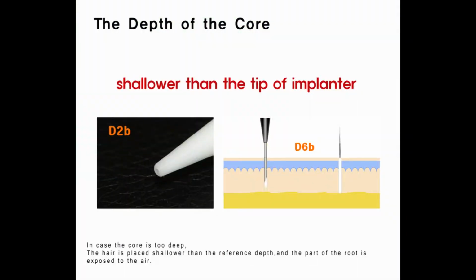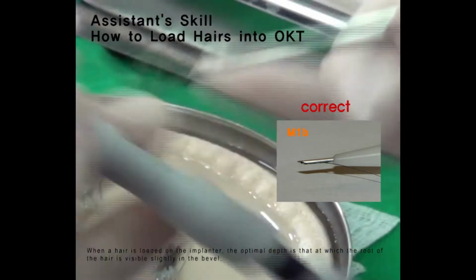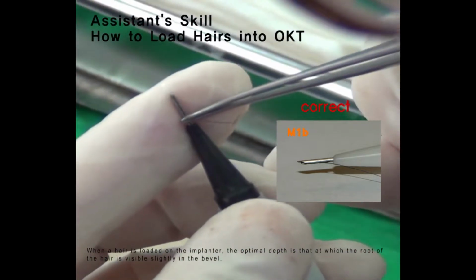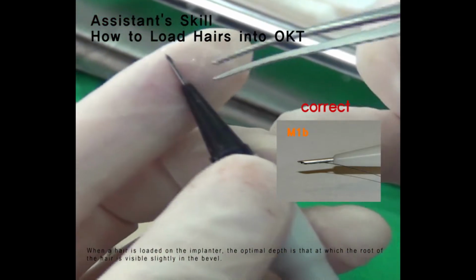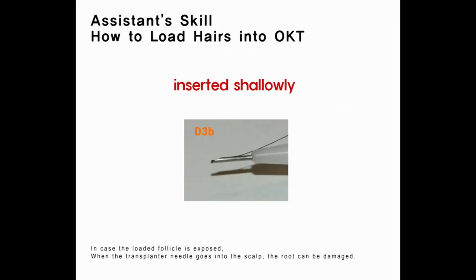In case the core is too deep, the hair is placed shallower than the reference depth, and part of the root is exposed to the air. When a hair is loaded on the implanter, the optimal depth is that at which the root of the hair is visible slightly in the bevel. In case the hair follicle is placed too deep, the transplanted hair goes less deep than the reference depth. In case the loaded follicle is exposed, when the transplanter needle goes into the scalp, the root can be damaged.